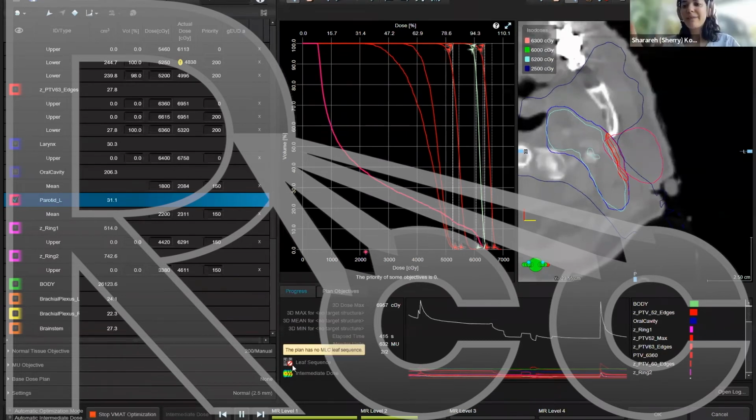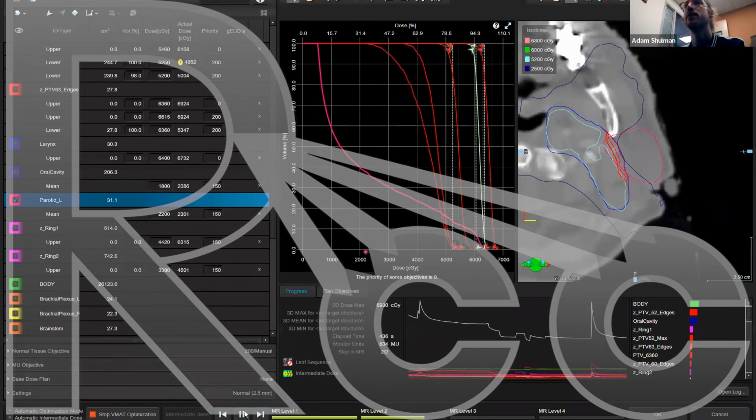Awesome. And Victor and Rola are talking about how their treatment planning system is different and they use Monaco. And maybe in the future, we can have some sessions for Monaco users. But I think our goal here is just to get the concept and be more familiar with the process per se. And of course, every treatment planning system is going to be different. Yep, exactly, Sherry. So we are going to have treatment planning tutorials start to finish with Monaco and Eclipse. So we will show both.